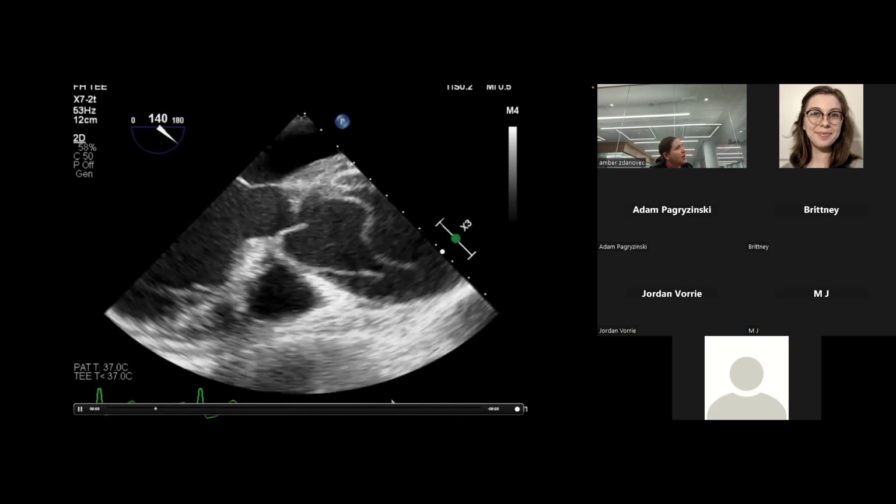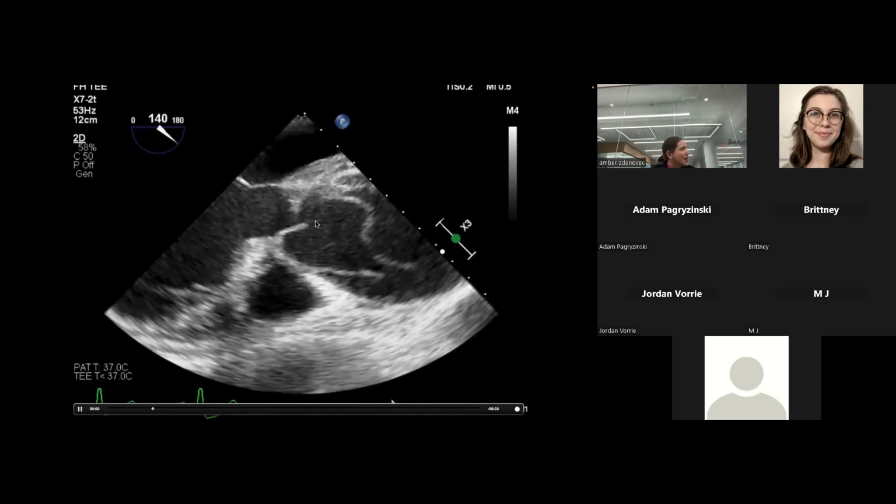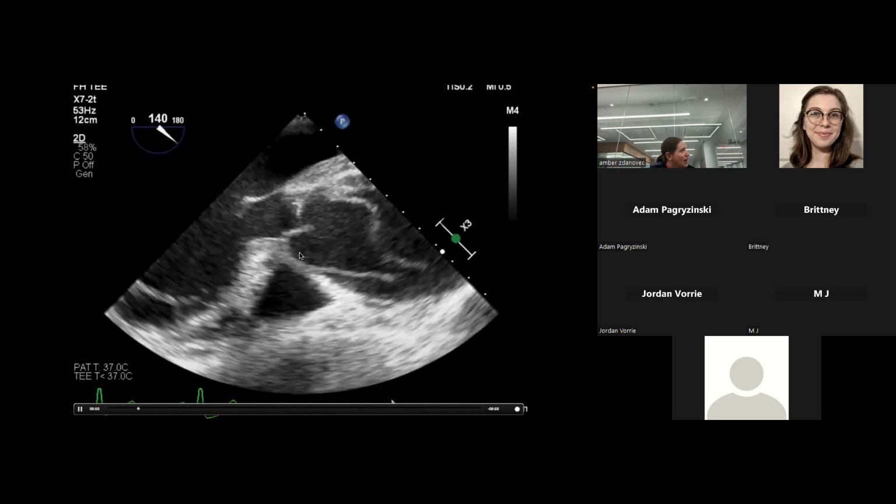Aorta. Which lumen are you talking about? So that's going to be your aorta. And what is going on with this aorta? Yeah, so you've got a dissection going on. This patient has a type A dissection. And what pathology do you think is also going on with this type A, looking at this valve?